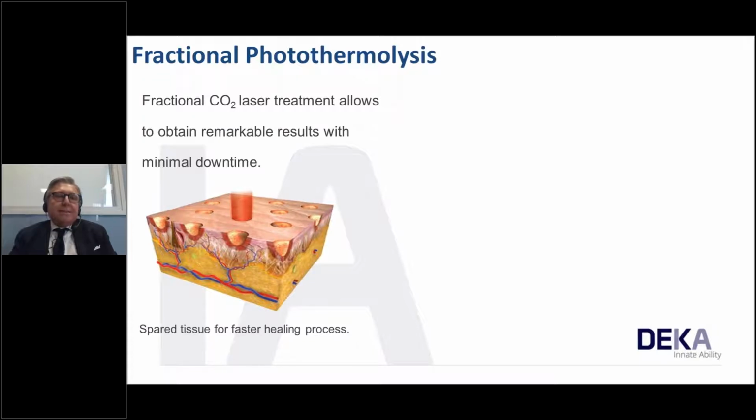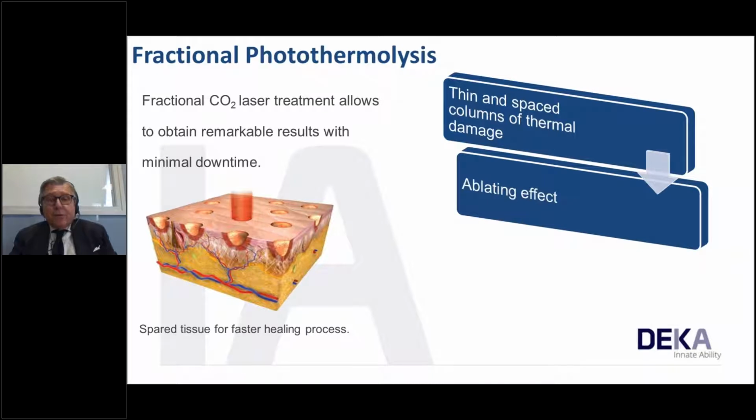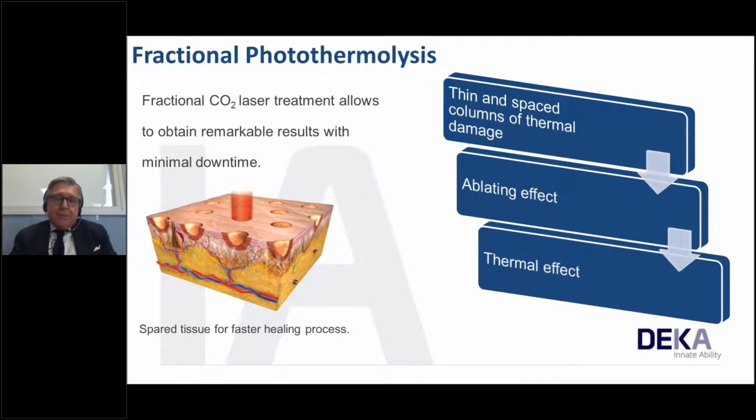Fractional photothermolysis is a treatment that allows us to obtain remarkable results with minimal downtime. We know this because we spare tissue for a faster healing process. We exploit the thin and spaced columns of thermal damage. We have a microablating effect and thermal effect in the tissue.